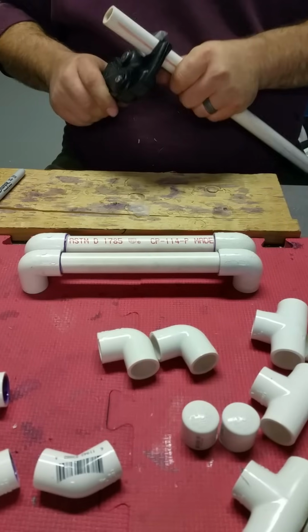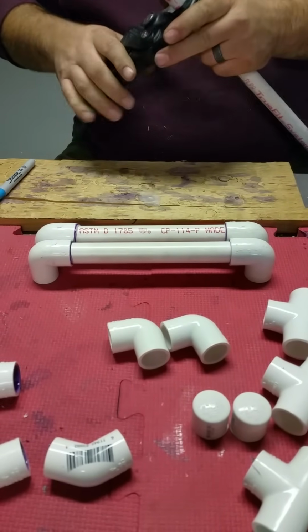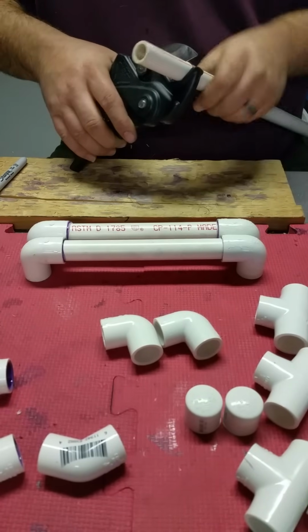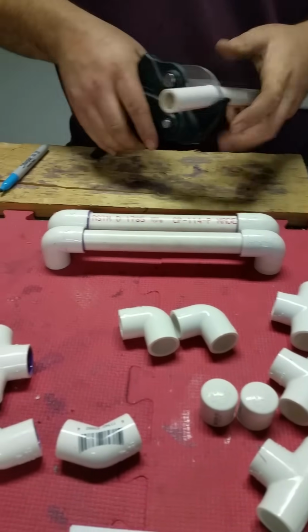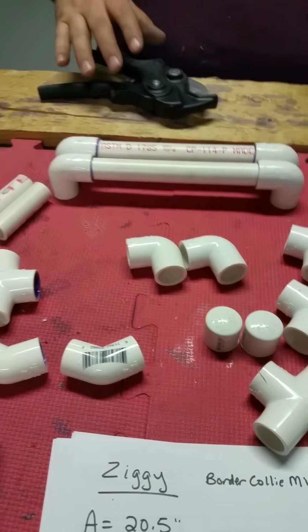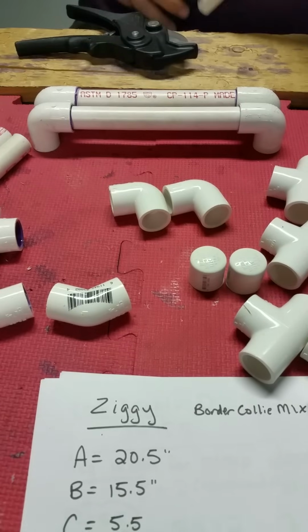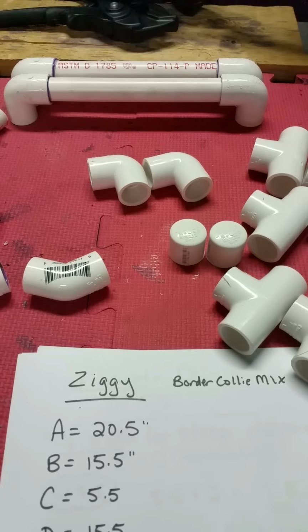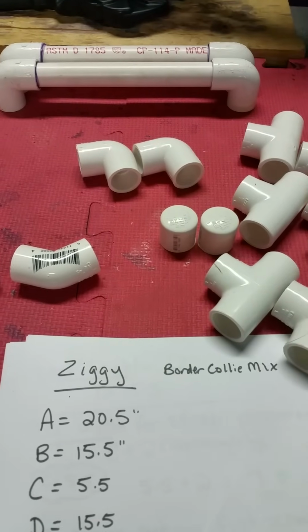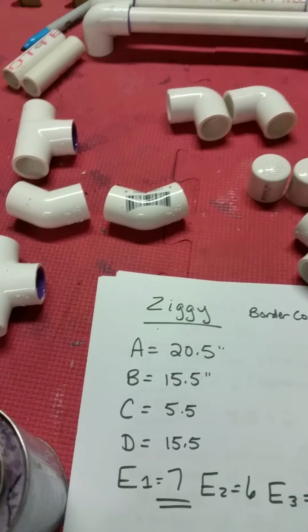If you have a big dog, you'll want to make this maybe 3 to 4 inches long. This gives the dog extra room to poop so it doesn't land on their cart. You might notice in the directions that it says 2.5 inches, but we have been doing 2 3/4 because some of the distance is absorbed within the end of the connecting joint.